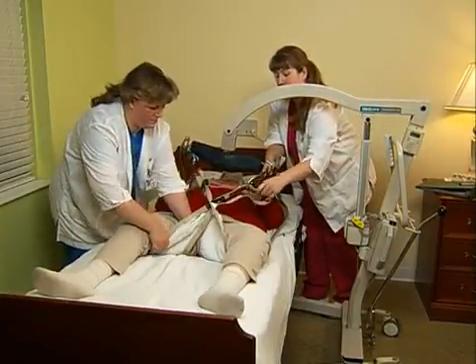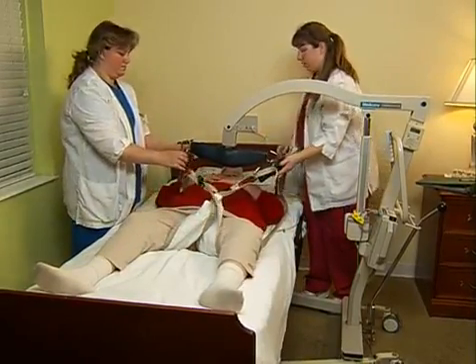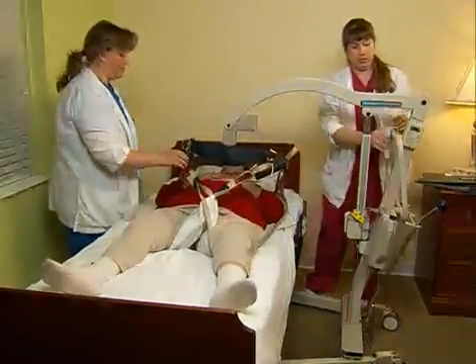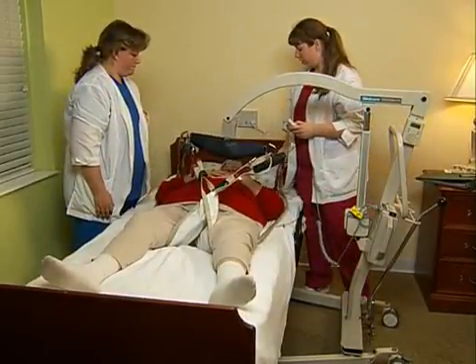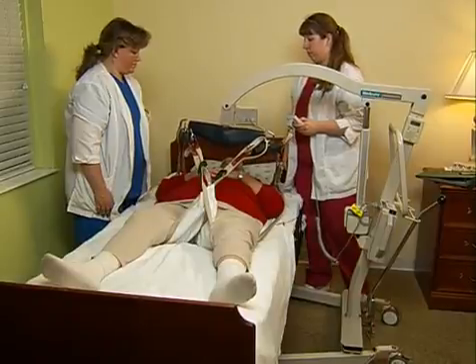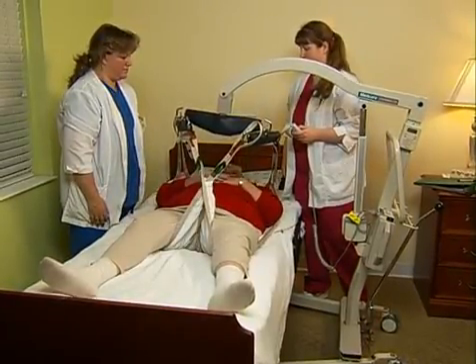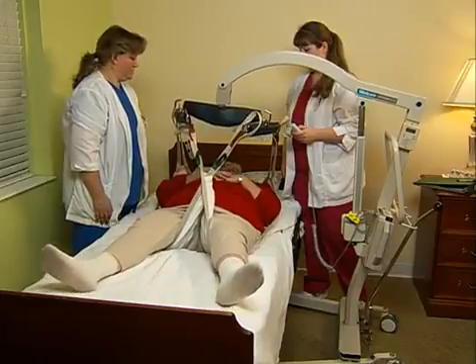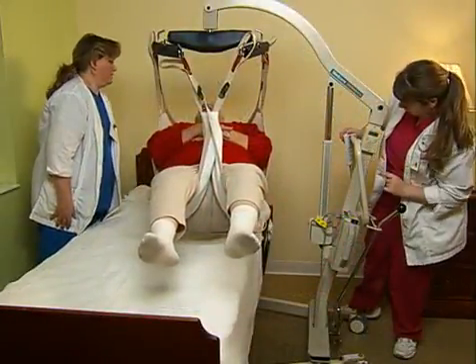Reassure the patient that she will not fall. Instruct her to stay still if possible. Okay, Miss Jones, we're going to lift you up. I just need you to keep your hands crossed. Slowly lift the patient in the sling until she has cleared the bed. There you go. Read the digital weight on the scale.